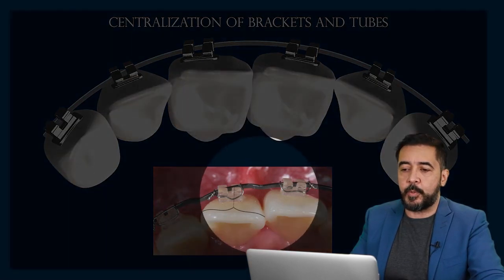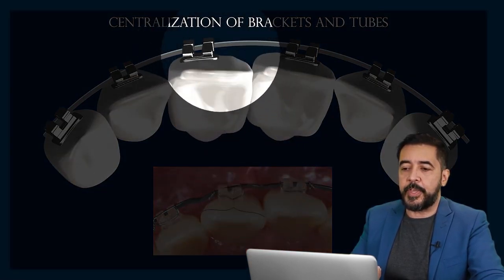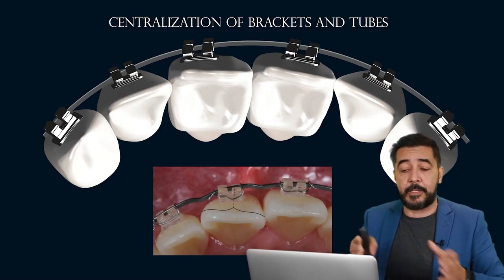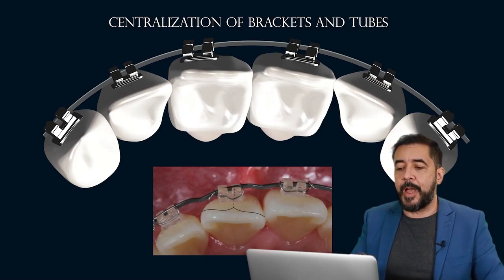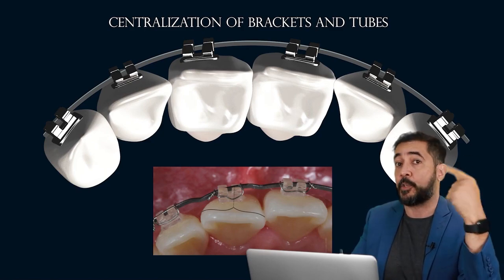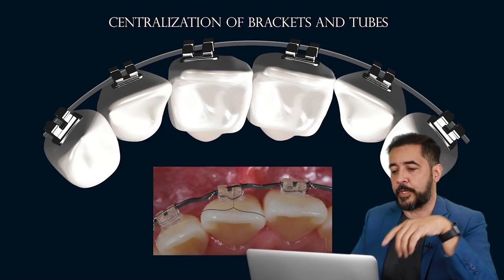So when we do the centralization, the first thing is covered. We are not going to commit this kind of mistake. We're not going to have to stop our treatment in order to correct something that we have done in the beginning of the treatment, okay?